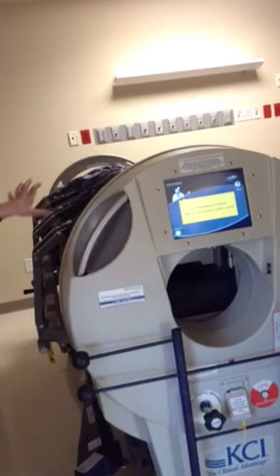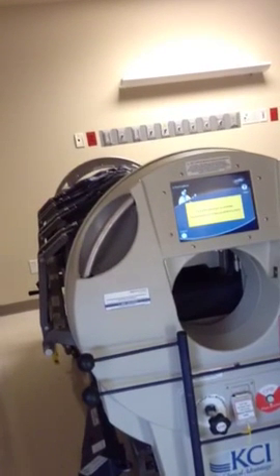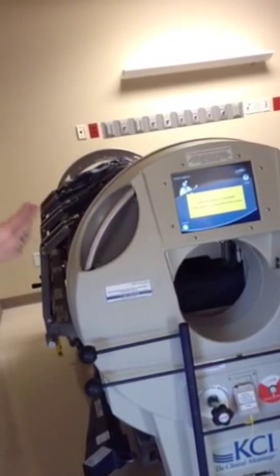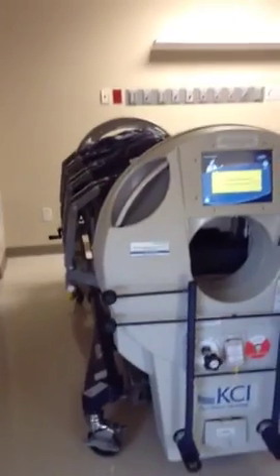So if your patient's on their back and you have to quickly get them over, or say there's a natural disaster, you've got to get them over in the hallway and you have no battery backup and they have to go back prone and you have no power, you can manually turn them over. So one person on either side, takes 3 people to do it.